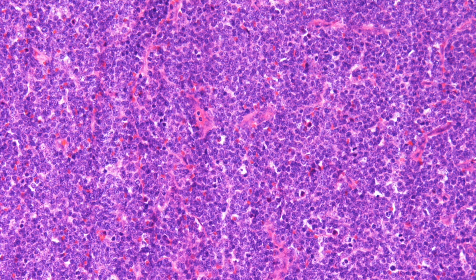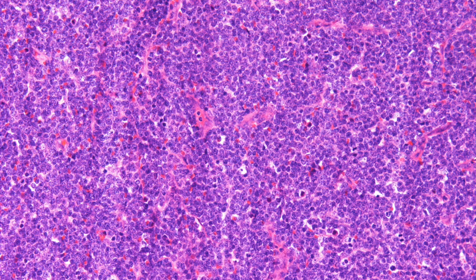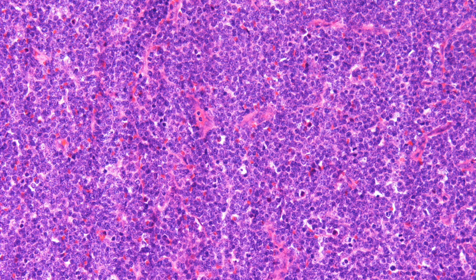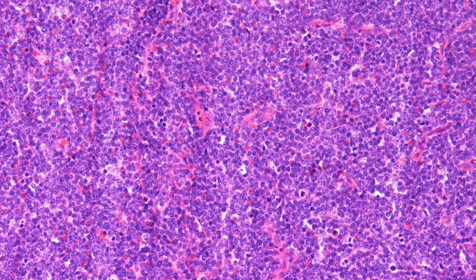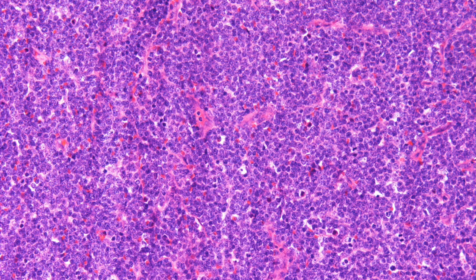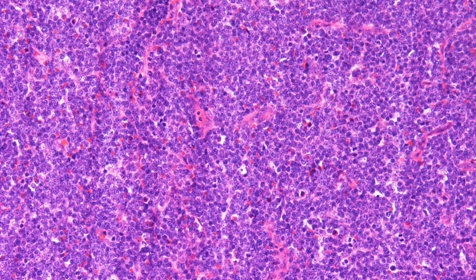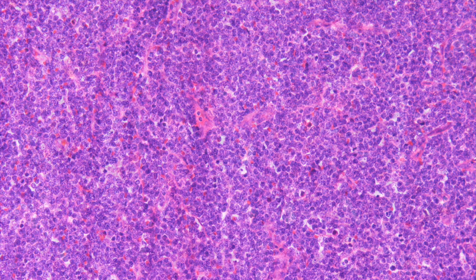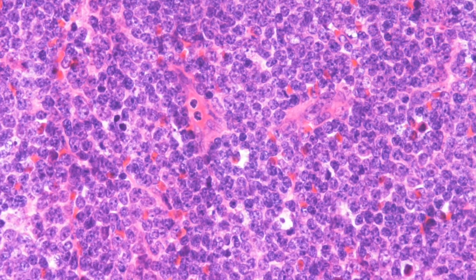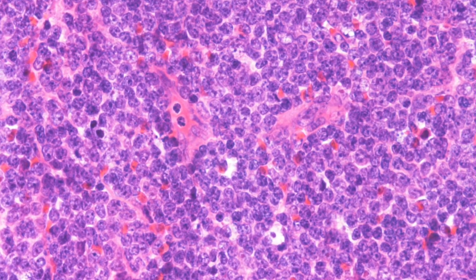A high magnification and this is the highest magnification.